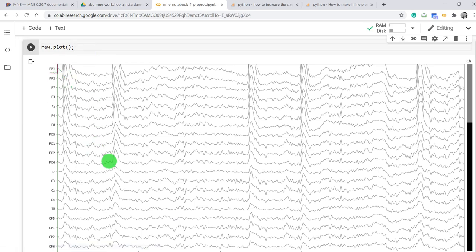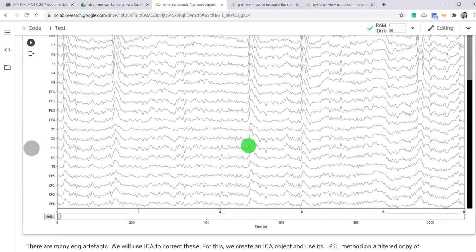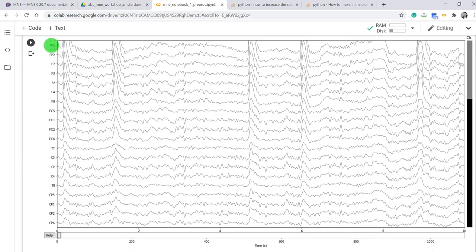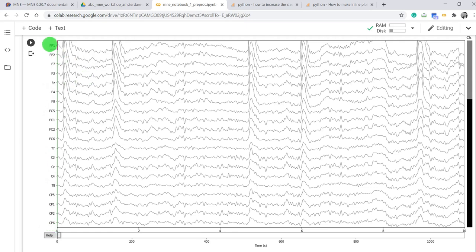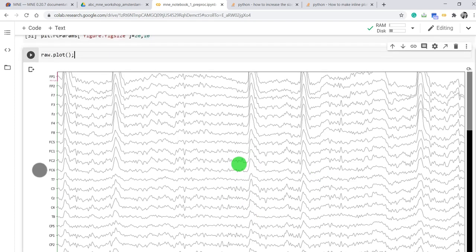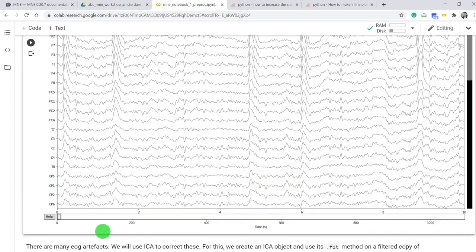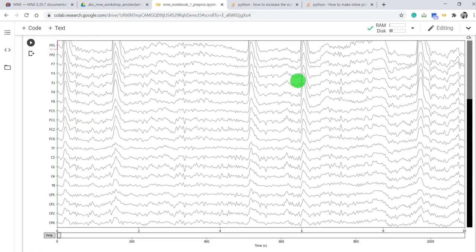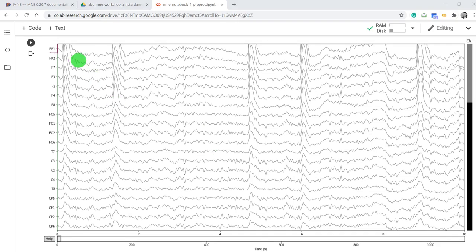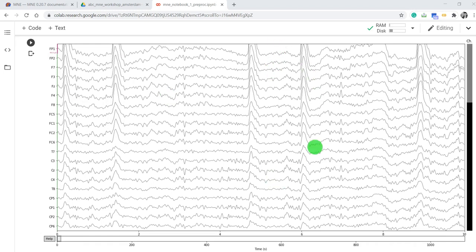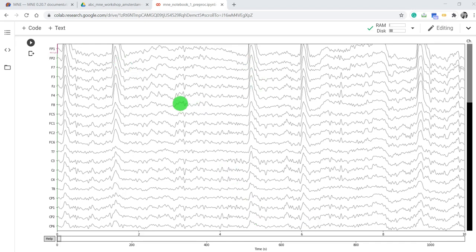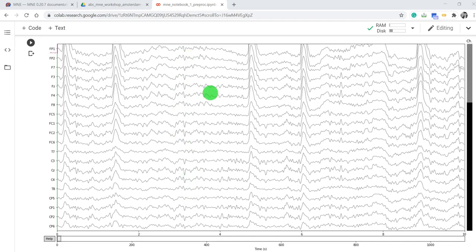Now let's try to plot how it looks like. So if you plot this continuous data set, we'll have the following visualization which shows the location channels and then time series or EEG channels. FP1, FP2, F up to CP6. So those are the subset of channels. And then these are time points. This is just one window time point window which we are visualizing. EEG and MEG data is buried in noise. So we can see different types of noise in the data. One of the common examples is shown here. These big amplitude waves. Look at this. Those are called eye movement artifacts. That's related to eye blink, basically eye blink artifacts. When you blink your eye, your brain data is affected. Of course, the EEG sensor picks up those artifacts as well. And also if you visually analyze, we can find some heartbeat related activities as well.